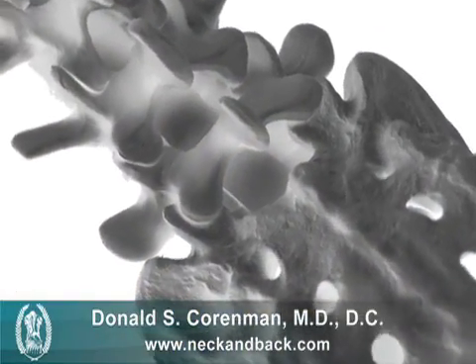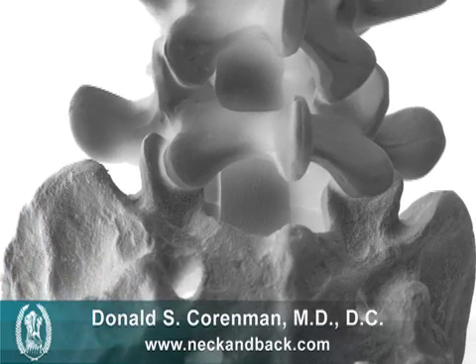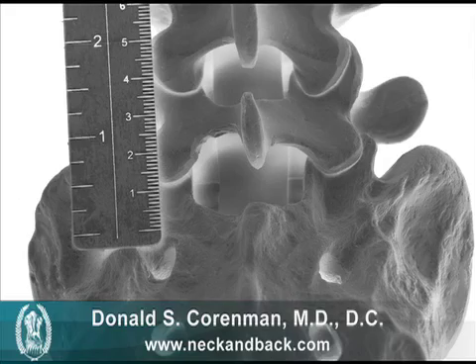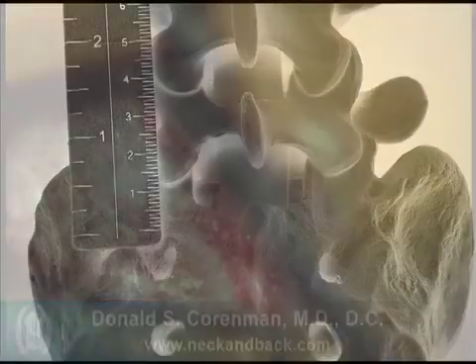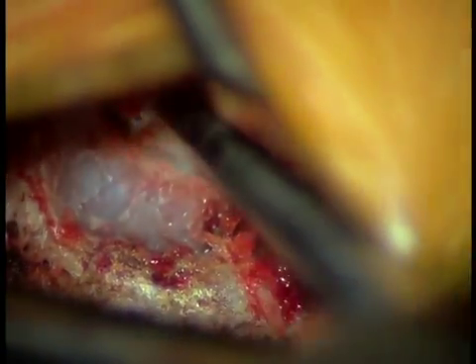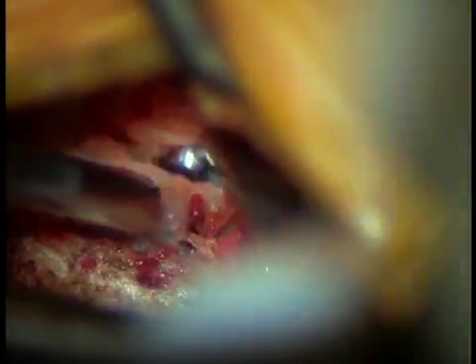We actually make our approach on the very side of the vertebra between the bottom of the lamina, and here you can see a little laminotomy — a little bit of bone taken away. This is the actual view of the lamina and this is the area we're going to start to remove some bone. Here's a burr taking off a little bit of bone, and now we're going to undermine that bone and remove it so we have a little window to get into the spinal canal.